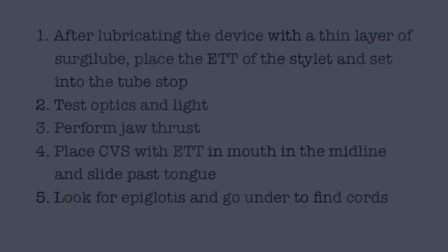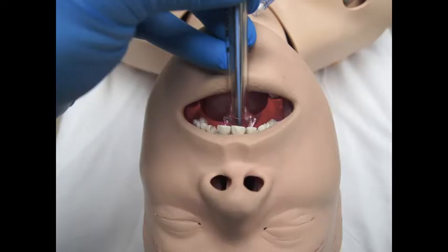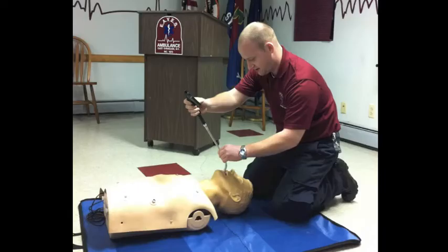After lubricating the device with a thin layer of Surgilube, place the endotracheal tube on the stylet and set into the tube stop. Test the optics and light, perform a jaw thrust, place the CVS with endotracheal tube in the mouth at the midline, and slide past the tongue. You will then visualize the epiglottis.